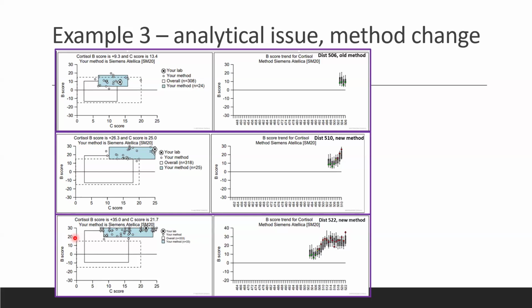The question is, what is the main implication of this significant positive bias? And how does it reflect on the cortisol result reporting, both in random cortisol assay, but also in dynamic function tests, including short synacthen test and dexamethasone test?